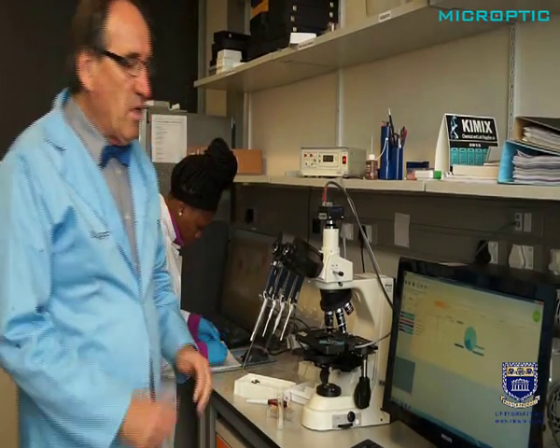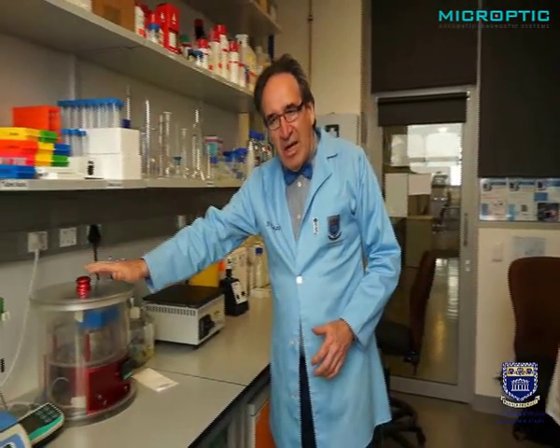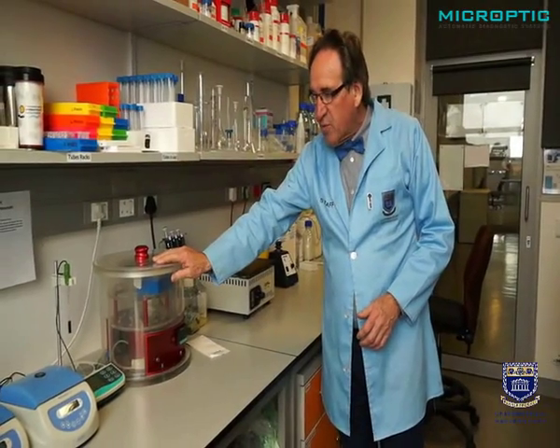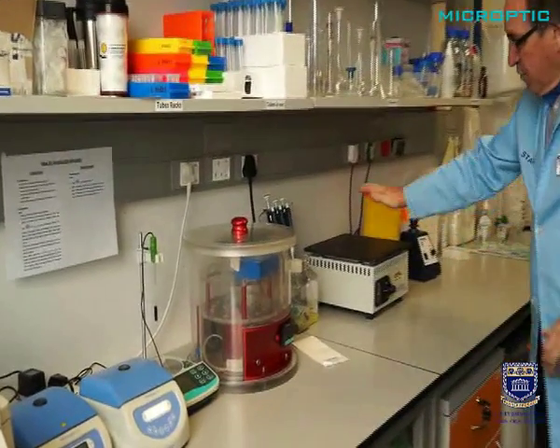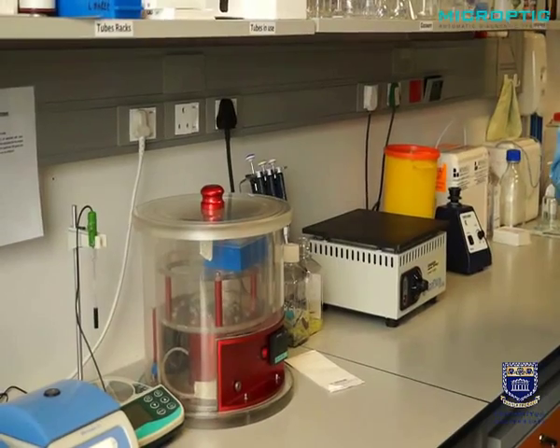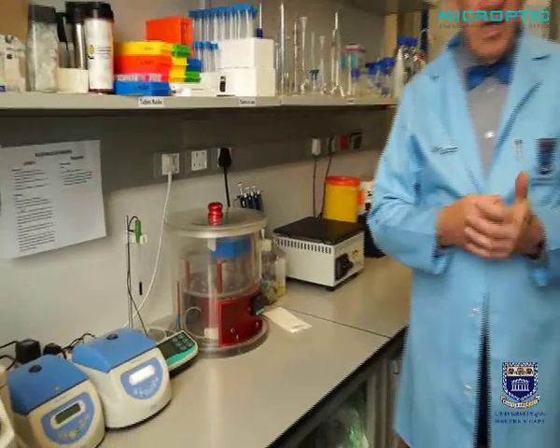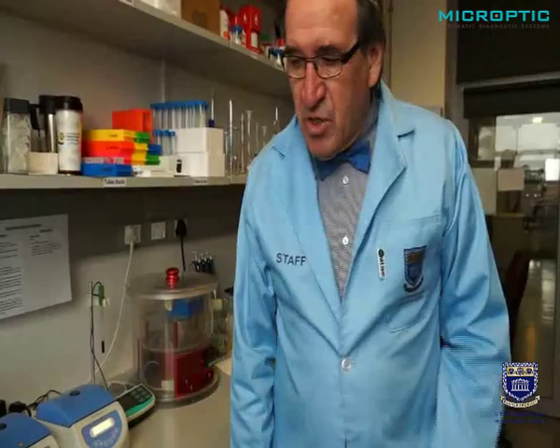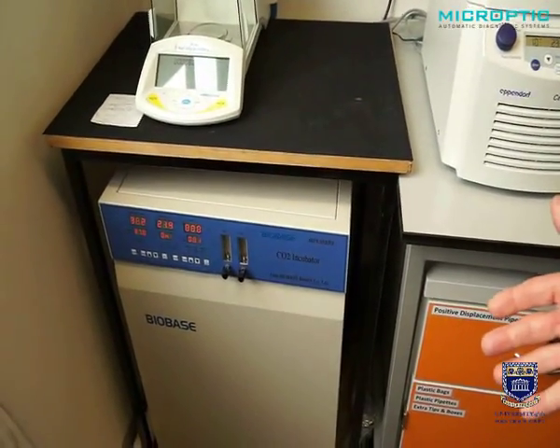What else is required? Yes, further temperature control. For example, where do you heat your tubes, your slides beforehand? We have this special incubator, but any incubator that controls at 37 degrees is fine. We also have one here for heating up slides before the time. And then, of course, if you want to do long-term experiments where you need to control the pH and to work with a bicarbonate buffer, we're going to use a CO2 incubator like the particular one we have here.